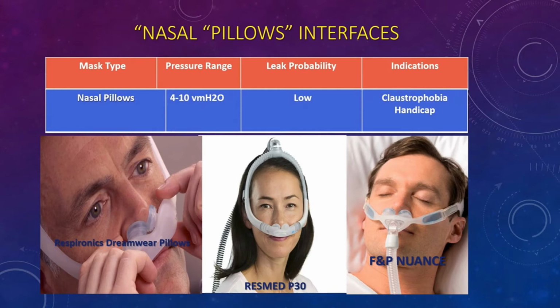One major disadvantage to the use of nasal pillows is mouth leaks. Oftentimes it's never mentioned or revealed during the mask fitting process, only to be discovered after a couple of nights when their sleep apnea returns because of the loss of pressure. The remedy for that is to try to use a chin strap to hold the jaw in place.